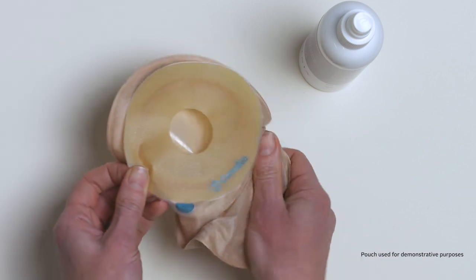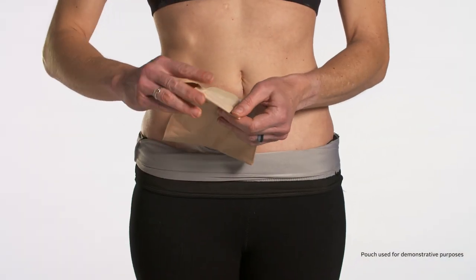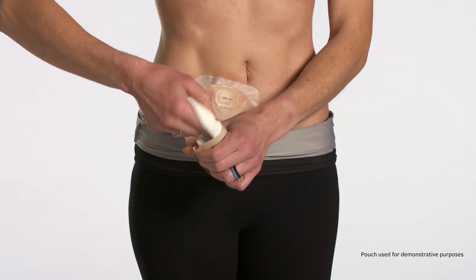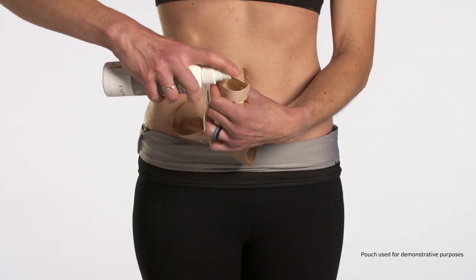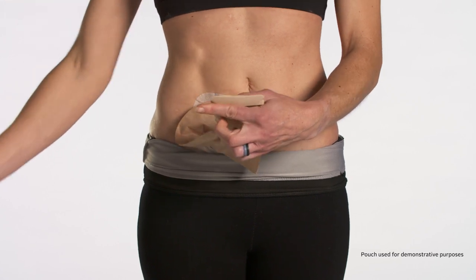Then apply your ostomy pouch as normal. To apply the lubricant into the tail or bottom of the pouch, first drain the pouch contents and wipe the tail closure clean. Place the nozzle near the opening and spray three to five times to coat the pouch.